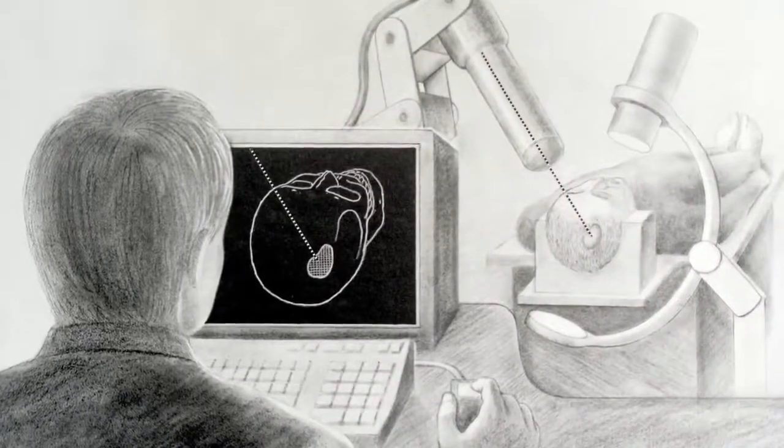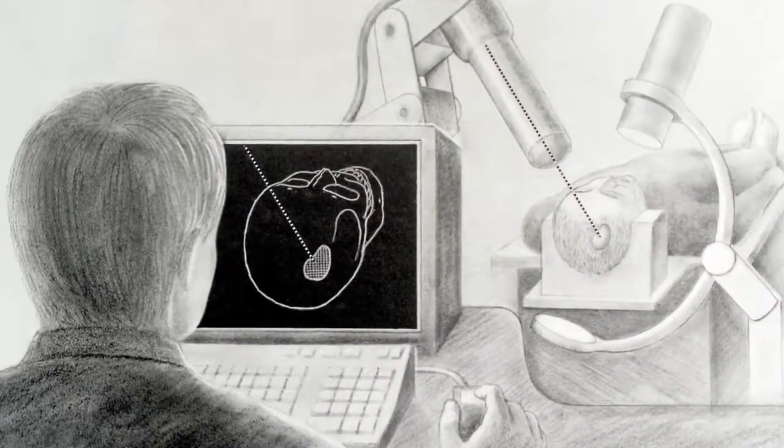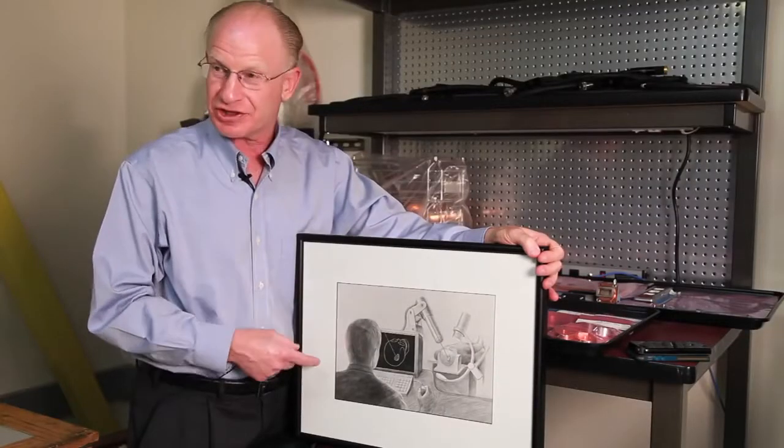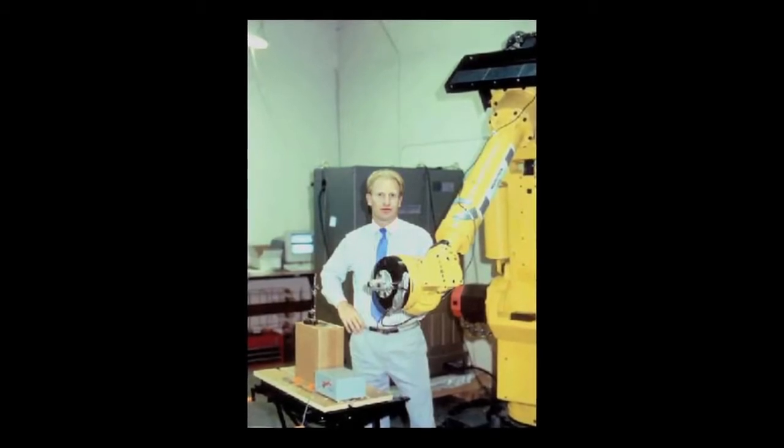This drawing was actually made in 1988. It tried to depict my ideas for the core technologies that would eventually become the CyberKnife. The challenges of bringing a team together and finding the money to make it real was just a huge challenge.